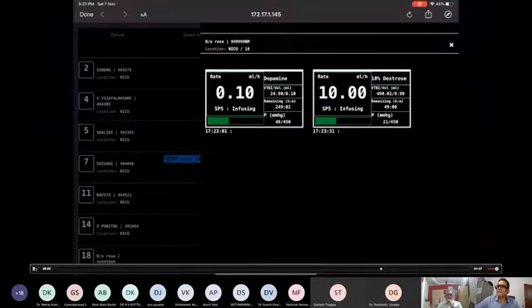This is an 8, and then what happens is this comes to the central station. So I start. This is the central nursing station, and this is infusing, and this is 10% dextrose here, and it's running at 10 ml an hour, and this is dopamine. So this is running at 0.1 ml per hour. It's infusing now. So that is the central station. So this is how simple it is.